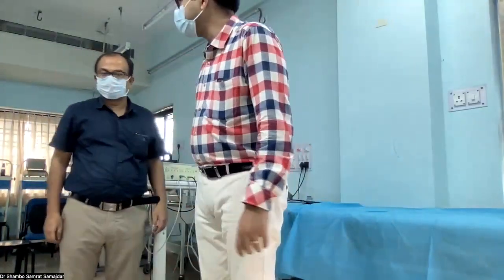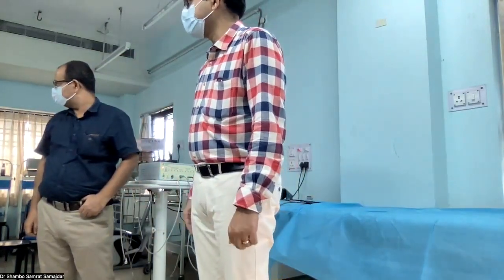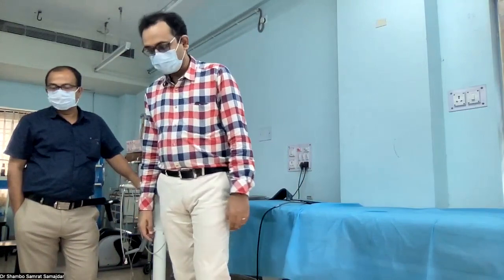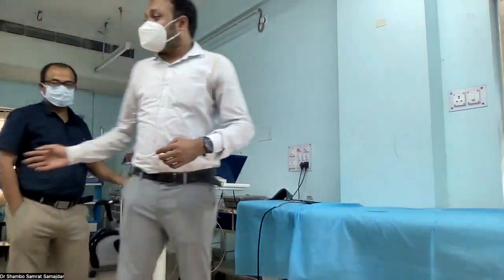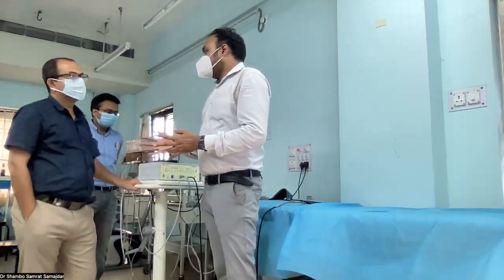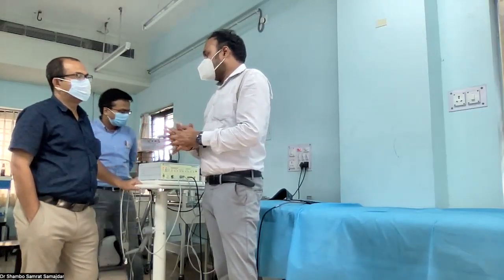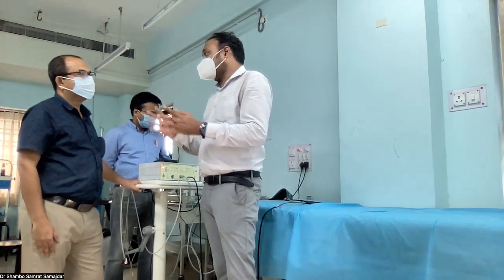Dr. Deepan, you can come and demonstrate. So we have Dr. Deepan Shah who will demonstrate this machine and then we can proceed for the testing. Okay, we have with us our volunteer, Dr. Jyotirmoy sir. Do we have any history, any prior surgery or anything like that? PCA, cardiac history, nothing. You have no case of hypertension or any other comorbidities as such?